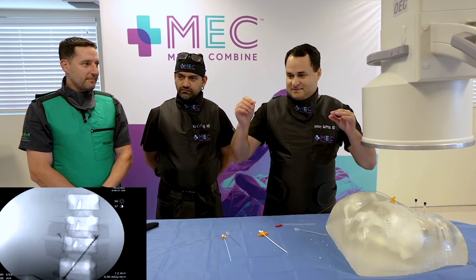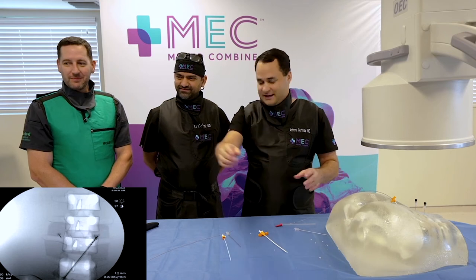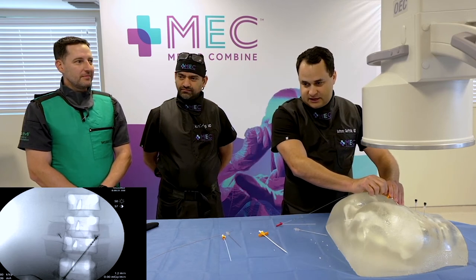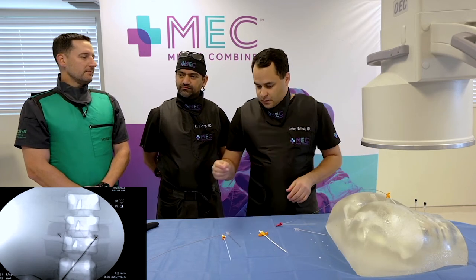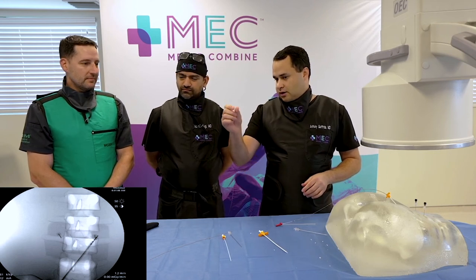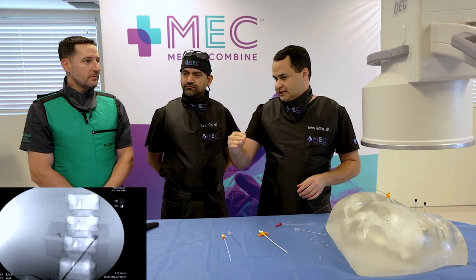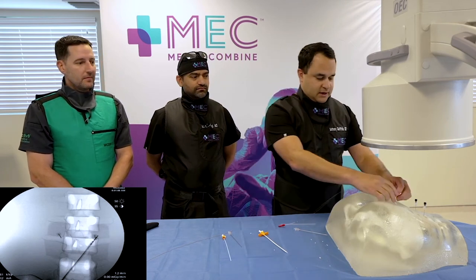You don't deploy by pushing the lead in — you deploy by pulling the sheath back. I've seen people push the lead in during a case, but we want the lead to live in that location. Once it's deployed, you can move it but it's tougher. Pull the sheath back; we know the proximal tine is just on this side of the distal lead, so the lead is deployed.